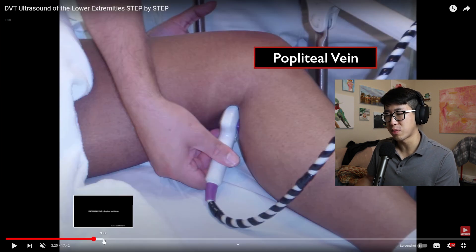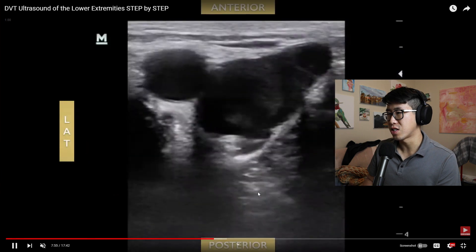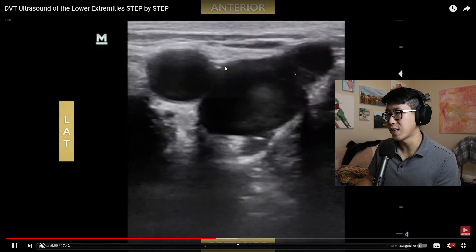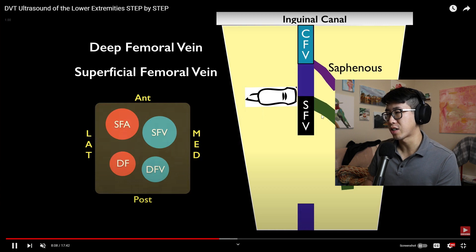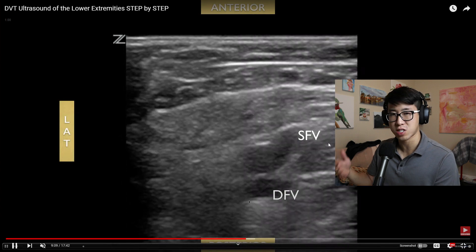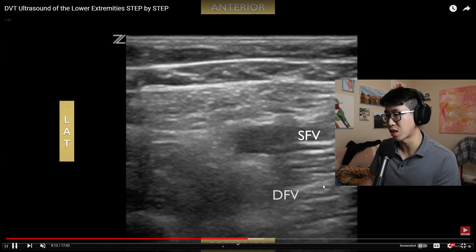The video shows the first point: the bifurcation of the common femoral vein and the great saphenous vein. You'll see the Mickey Mouse appearance — the great saphenous vein, the common femoral vein, and the artery. Then they slide down the femoral vein looking more distally. You have the superficial femoral vein, which is actually a deep vein, and the deep femoral vein — and you can see both of them are compressible.